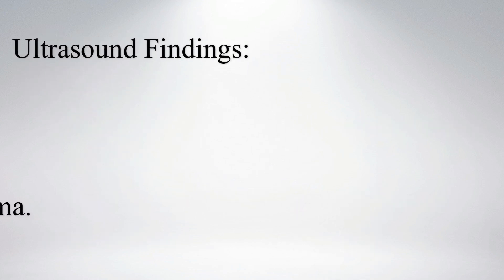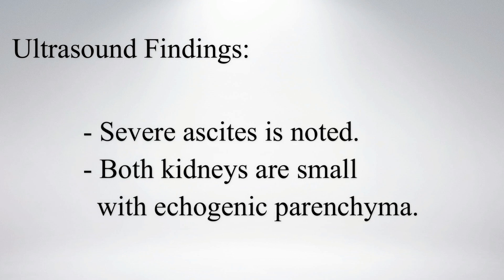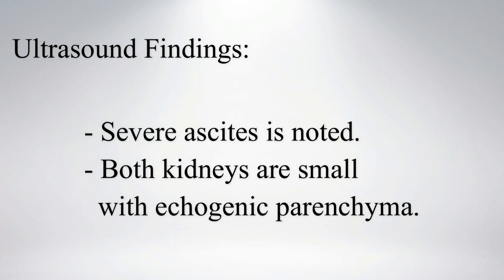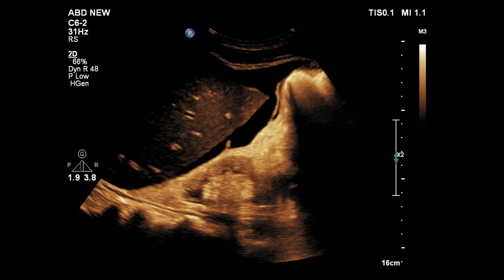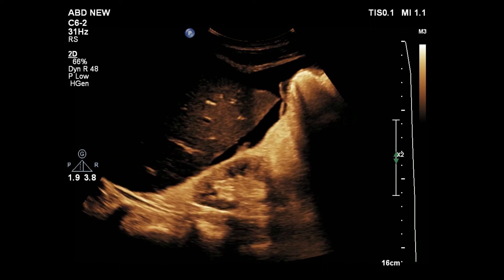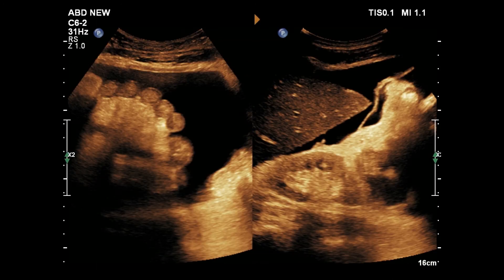On ultrasound, both kidneys appear small with echogenic parenchyma. Severe ascitic fluid is noted within the abdominal cavity. You can see an echogenic small right kidney of around 7 cm length and anechoic fluid at Morrison's pouch. Fluid extends up to the upper pole of the right kidney.